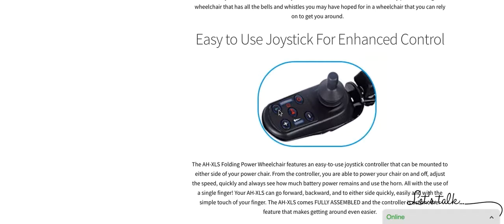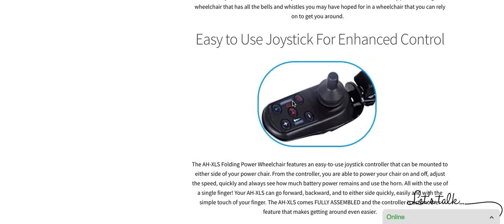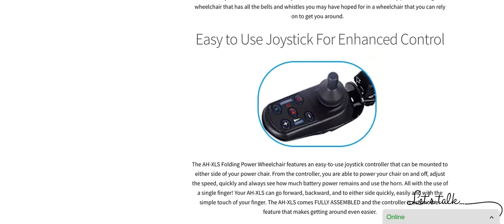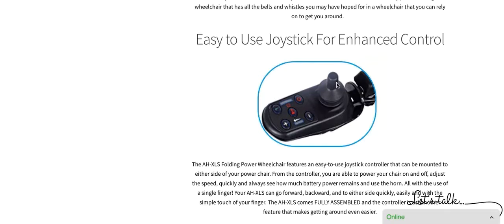You can see that the joystick, the easy-to-use joystick, allows you enhanced control. The green powers the actual wheelchair on. The red powers the wheelchair off. This indicator light right here lights up when you turn the chair on. You have green bars, orange bars, and red bars. So literally, at all times, you can see exactly how much power that chair has or how much battery life that chair has. It has a built-in safety feature that after about five minutes of non-use, the joystick will shut off so it doesn't drain the battery. And you can press the plus button to increase the speed, the minus to decrease the speed. All at the touch of your fingertips.